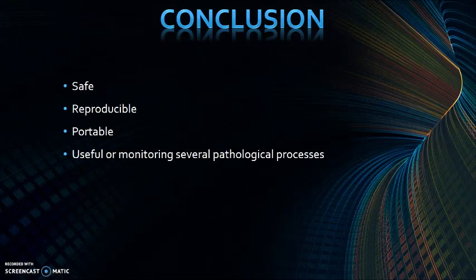All right, so to conclude, transcranial Dopplers are safe. The findings are reproducible. The exam can be done portable if the patient is in the ICU, and it is useful for monitoring several pathological processes.